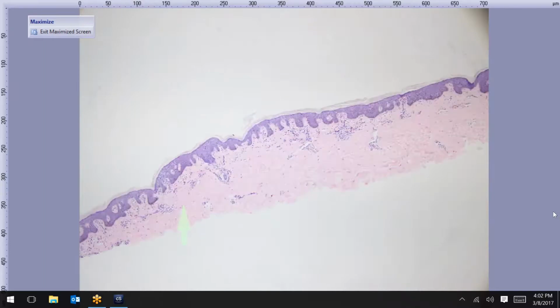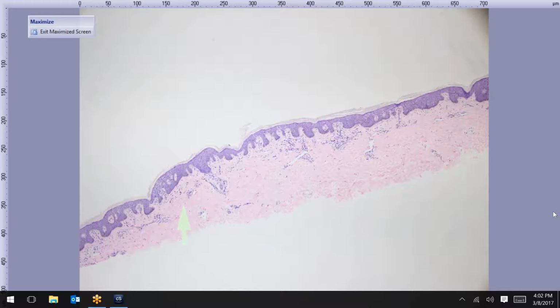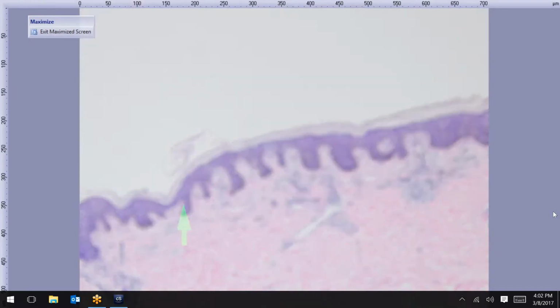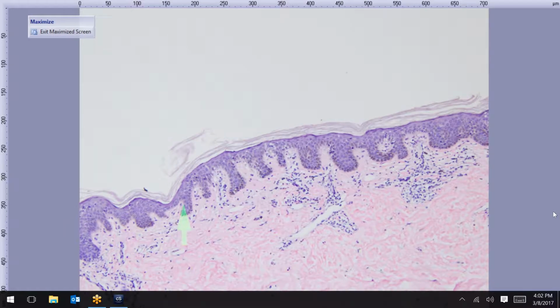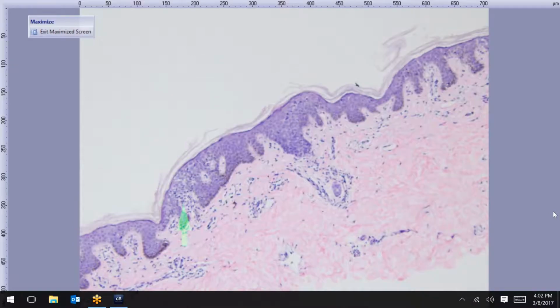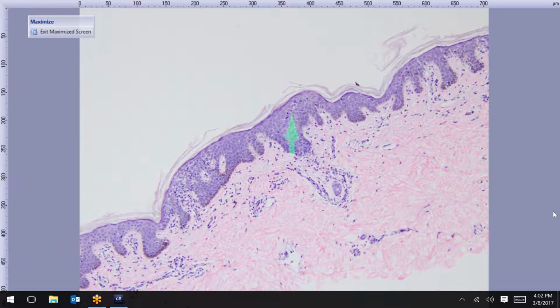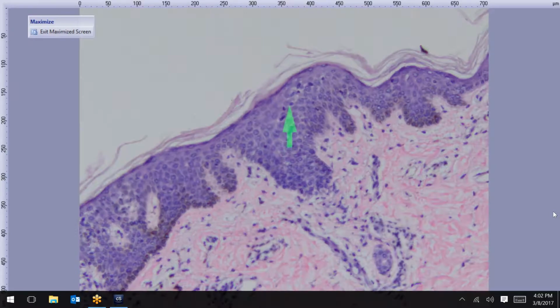We'll go on to another recent case, and we'll go on a higher power. Patient has a 15-year history. This is a patient from our practice. A 15-year history of light patches of skin, and a dark-skinned person, but relatively light patches of skin. And I think somebody already put a good comment in, and that is perfect. Yeah, so you have appreciated these lymphocytes in the epidermis, and so this is in fact Mycosis fungoides.